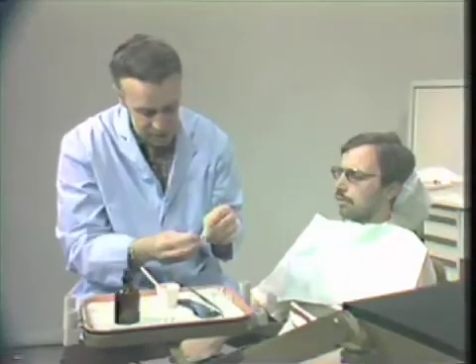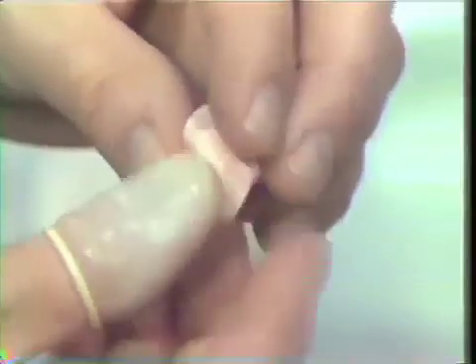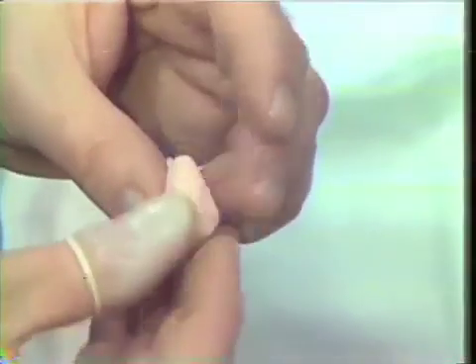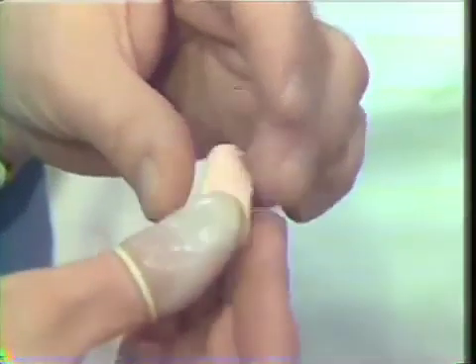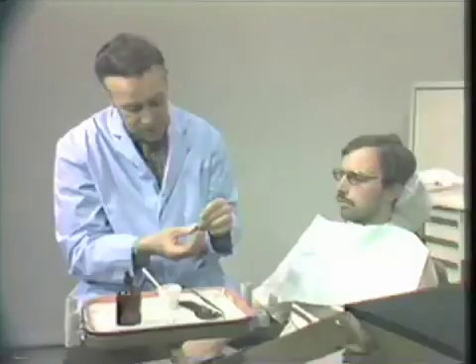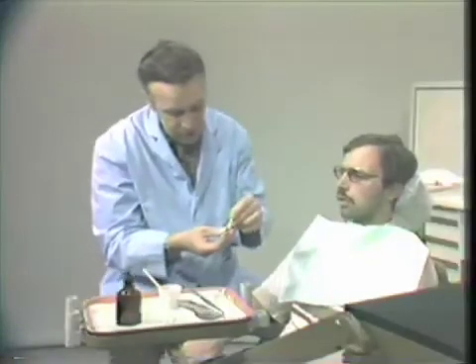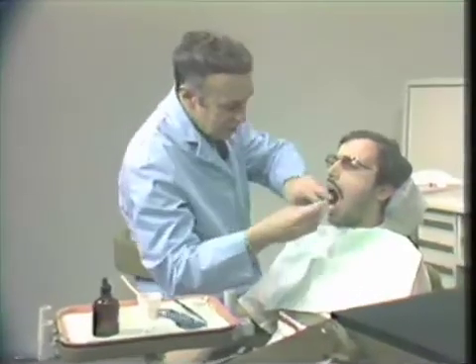As you can see, it's still just slightly tacky, and we would like to have it in a little bit more doughy consistency. And the longer that we can hold this out of the oral cavity, the less chance of causing any irritation to the soft tissue. Well, we're just about ready to apply it into the patient's mouth. Would you open, please? Thank you.